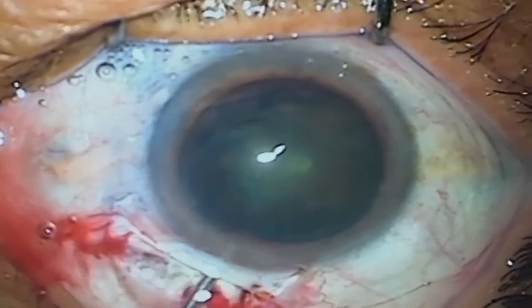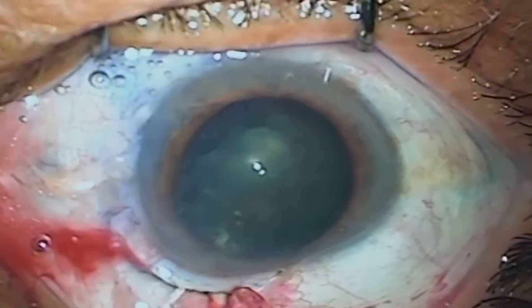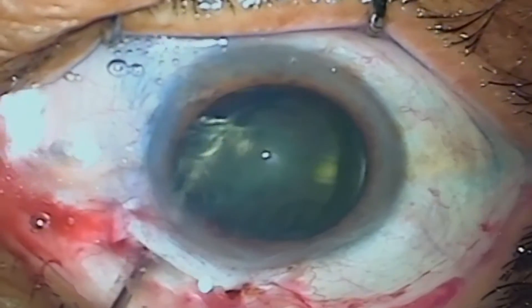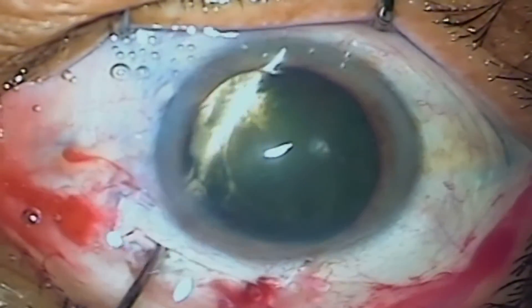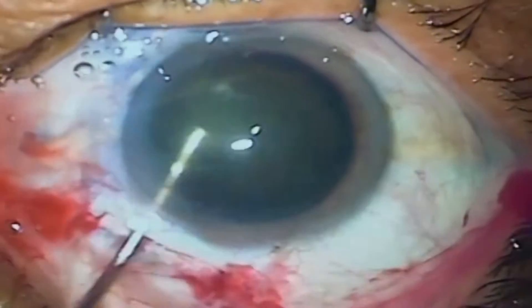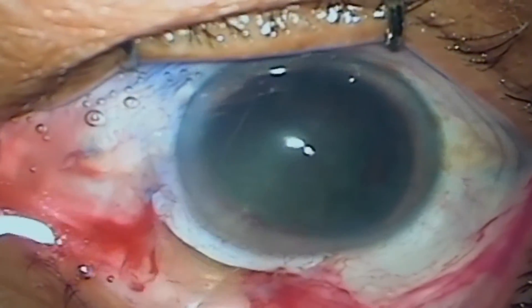During IOL implantation also keep in mind not to injure the iris under the incision. Use an adequate amount of viscoelastics. Do not rub the iris with the irrigation-aspiration cannula when bringing out cortical matter or viscoelastic beneath it.